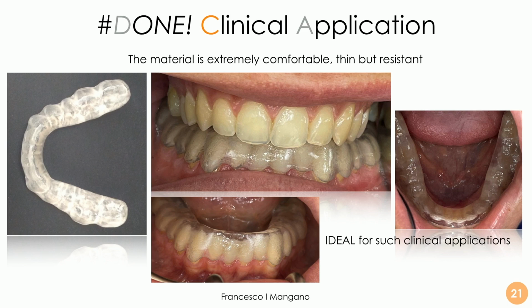That is also quite difficult because of the material, and the best thing is to proceed this way. It's very reliable, very accurate, very long-lasting, because we have some patients with this bite for months and they don't have any issue from a mechanical point of view.